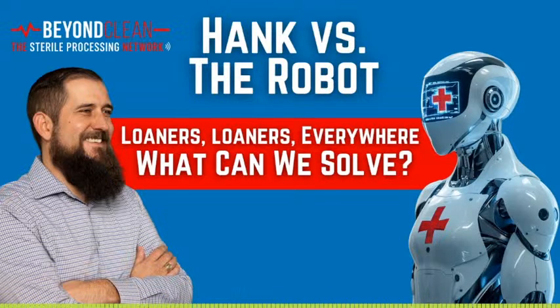Specialized instruments often have unique cleaning challenges: lumens, hinges, or textured surfaces. Familiarity improves the chance of catching bioburden and addressing it properly. Second, specialization doesn't just improve quality, it drives efficiency. The more comfortable techs are with these trays, the faster they can inspect and reassemble them without sacrificing safety. This reduces bottlenecks and the stress of rushing to meet OR deadlines.